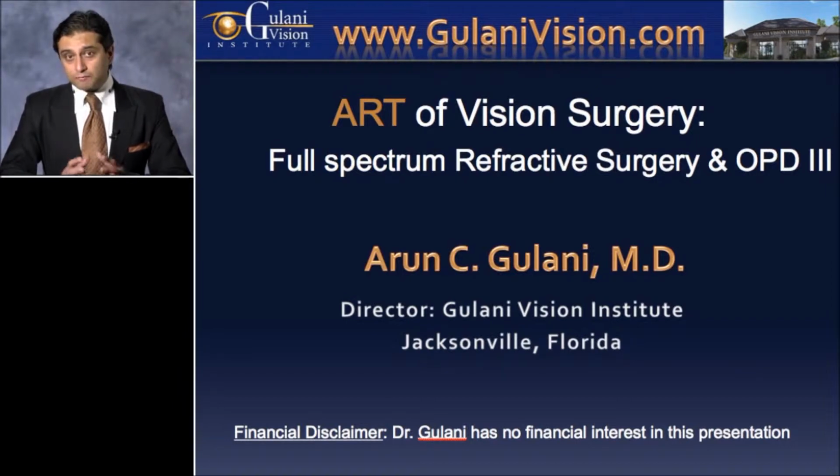The plan actually unfolds after the investigation is done, which is, let's say in this case, a patient comes in with any case scenario. When you do the OPD-3 testing, the efficiency of the technology allows me to get the refractive error, keratometry, spherical aberration, pupil size, angle kappa.